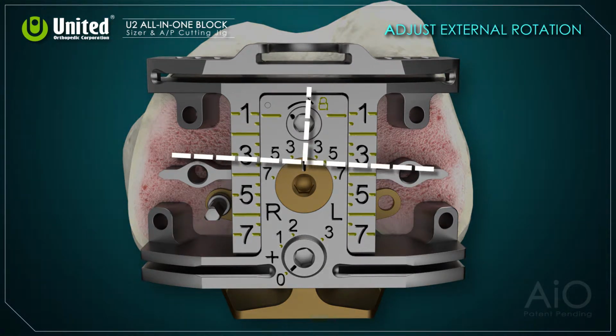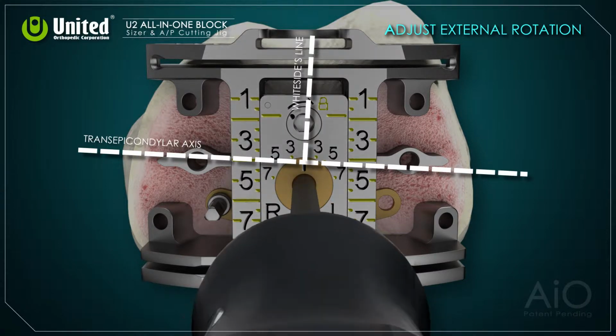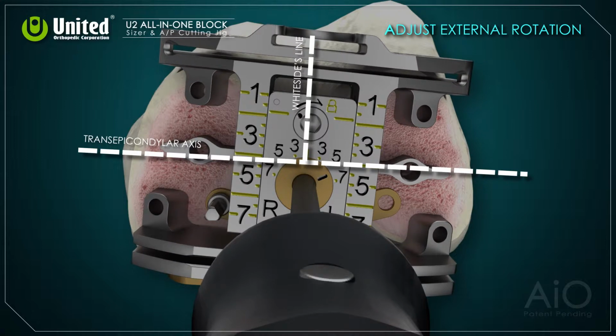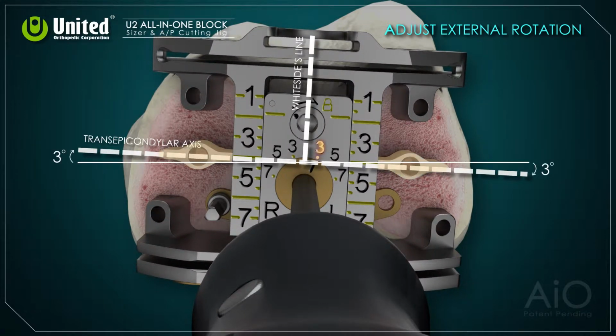Adjust the desired external rotation to be parallel to the transepicondylar axis and perpendicular to the Whiteside's line by rotating the central knob with a screwdriver. The marking indicates the degree with reference to the posterior condyles and can be adjusted from 3 to 7 degrees. In this case, left knee 3 degrees would be appropriate.